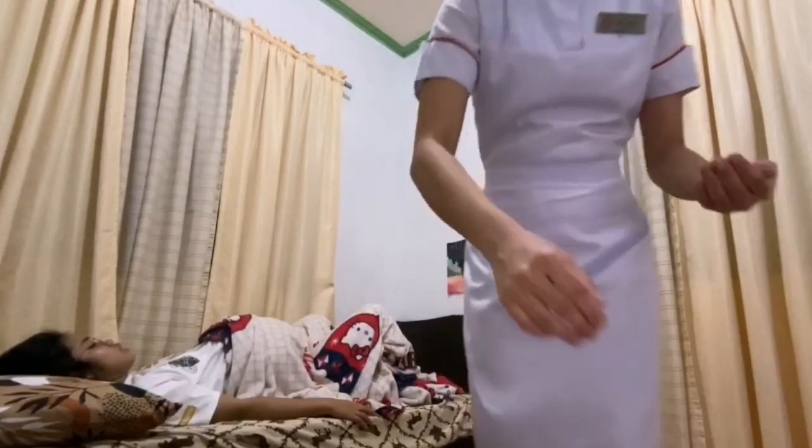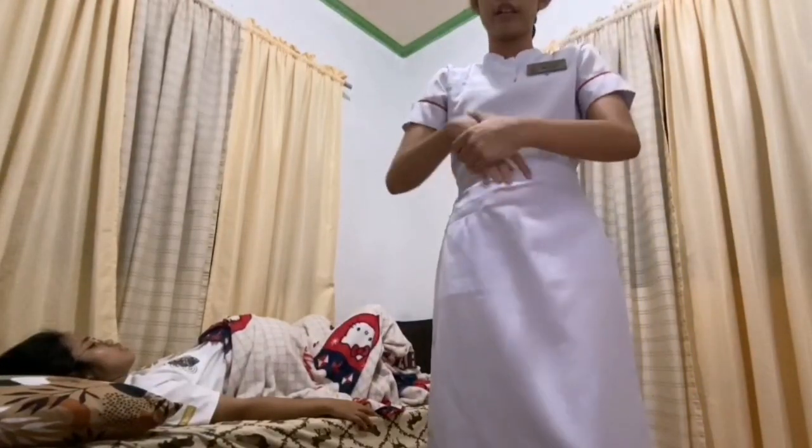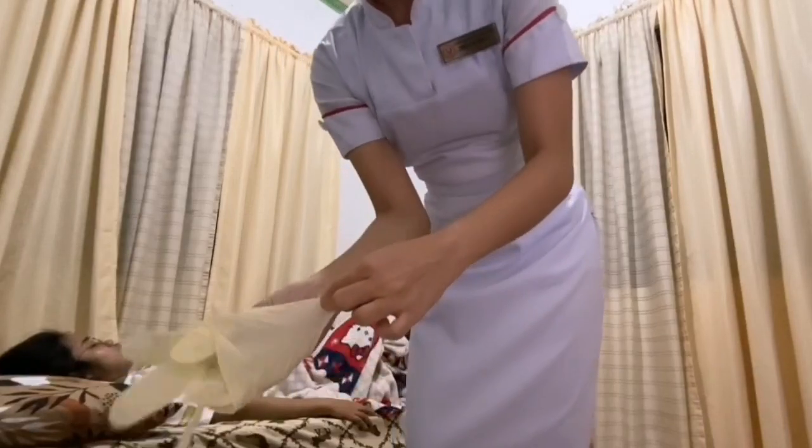Then, wash hands with clean water and soap. Put on gloves just before delivery. Perform double gloving technique. So, I'll be using an alcohol. Assuming that I will be performing a double gloving technique.